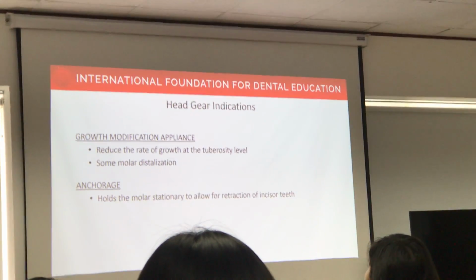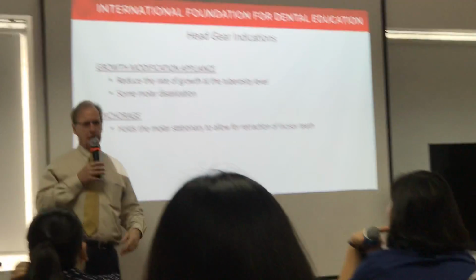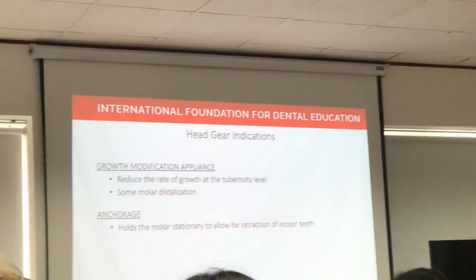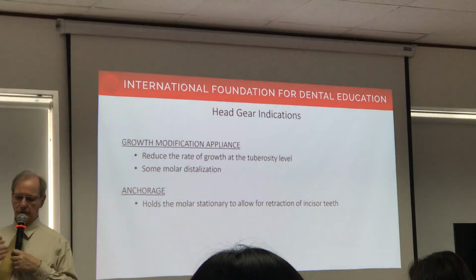So of course today in the anchor unit, if you wear 12 hours a day, you will get some stationary molar, while you can retract incisors. In a case you didn't need too much incisor retraction, that was fine.